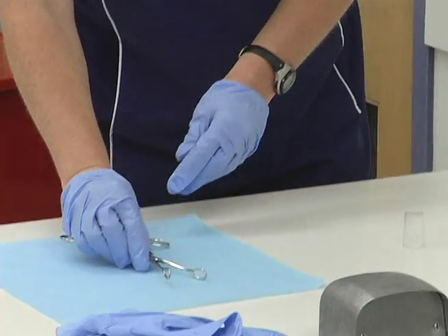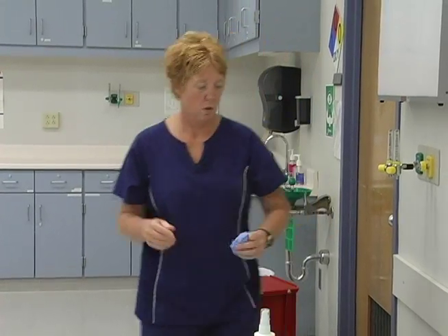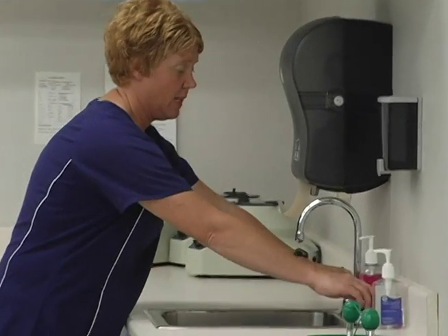Leave your instrument here to dry. Remove my gloves and wash my hands.